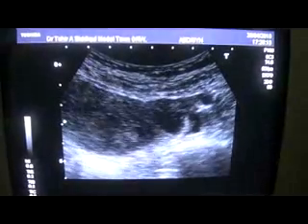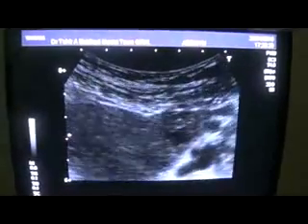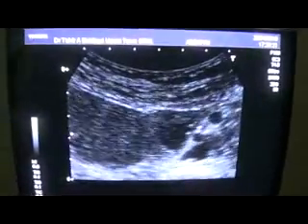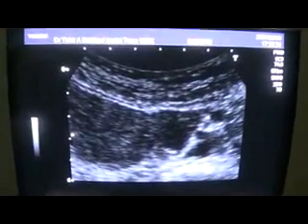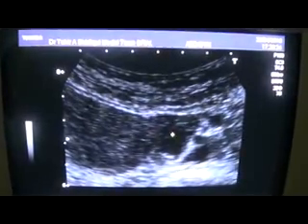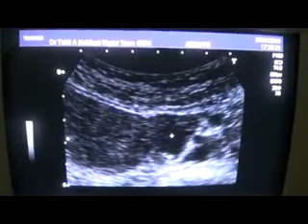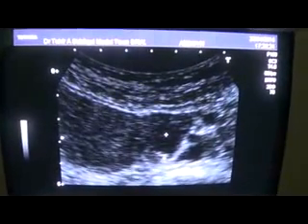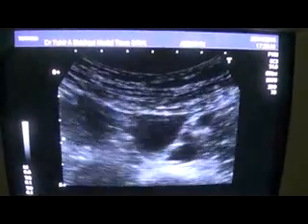This is not a fresh bleed, but this is a bleed. This is the left tube, or the fallopian tube. Here is the sac deformed, measuring approximately 11 mm — this is a hematoma.